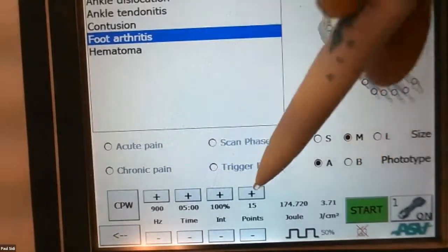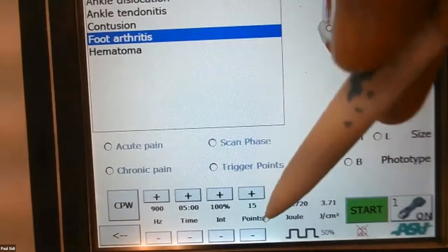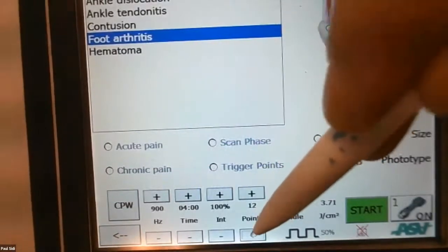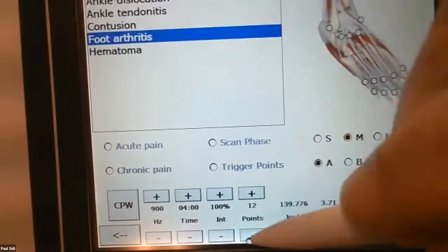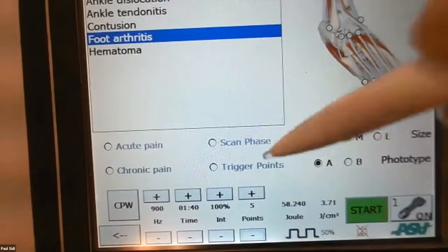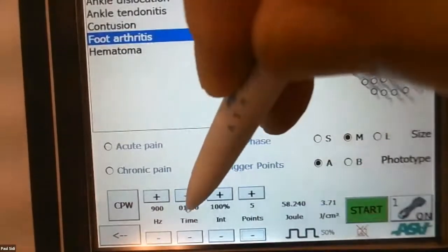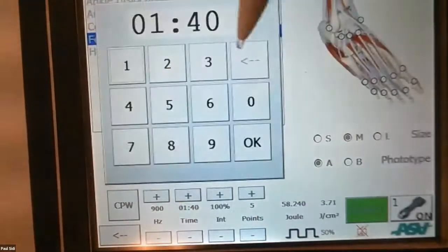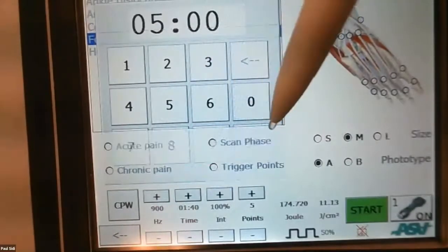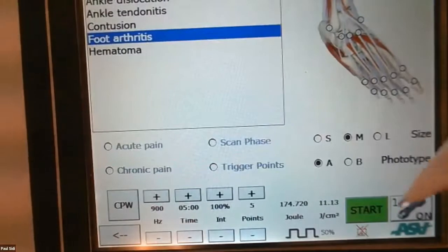But the problem is, 15 points. I don't want 15 points. I'm going to bring this right down to probably about 5. Right. 5 points there. You see the time has changed. I'm going to get this back to 5 minutes. Press on there. 0500. Press OK. And I'll start.